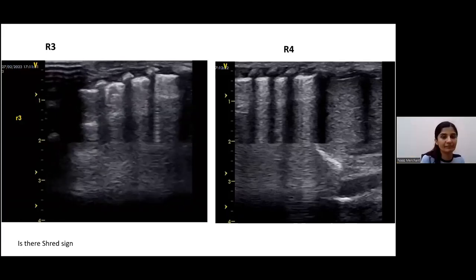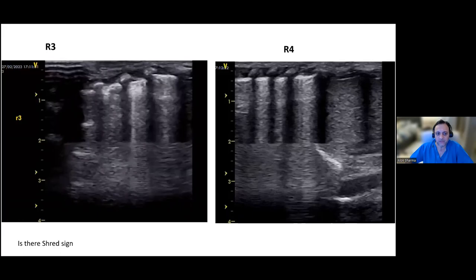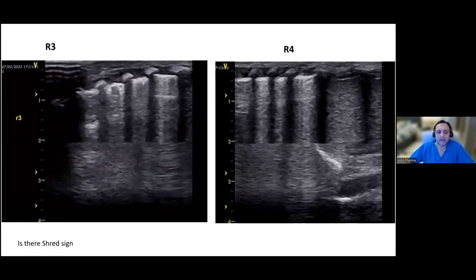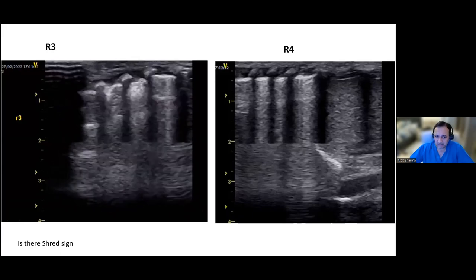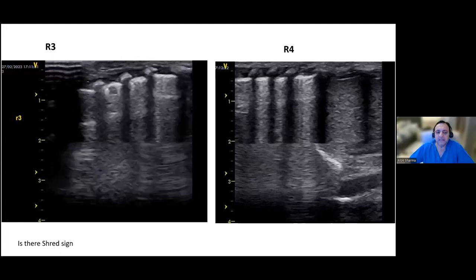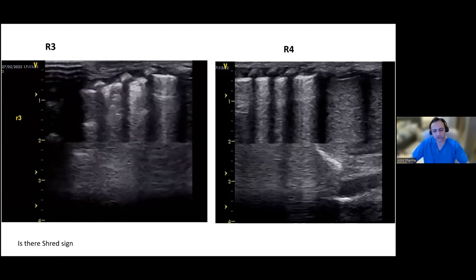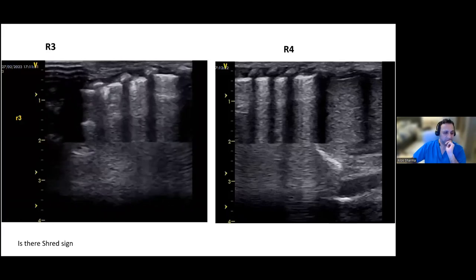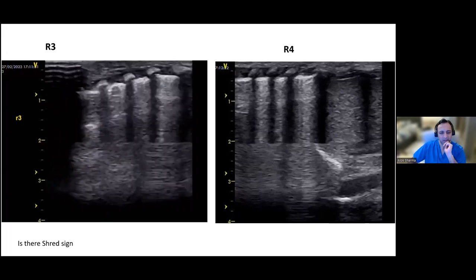The reason you're losing out on the deep part of your image at this point is you're not getting depth penetration of sound waves. So that is a dead area. What you might have to do is drop your frequency. The frequency you were using was 10? 12. It's a 27-weeker. Ideally, you should be able to penetrate very nicely, so it's a little bit unusual to get a complete blackout in that region.